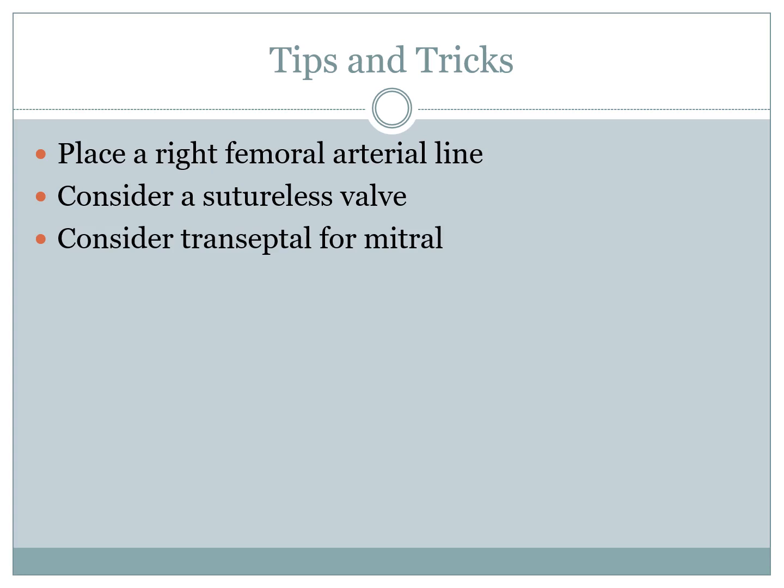For mitral valve surgery with a redo, I often like to do a transseptal approach, especially if I'm actually doing tricuspid surgery at the same time. Transseptal gives you a much closer position to the mitral valve than you'll get through the Sondergaard's plane. And if you're doing a tricuspid, then you only have one external suture line that's going to bleed.